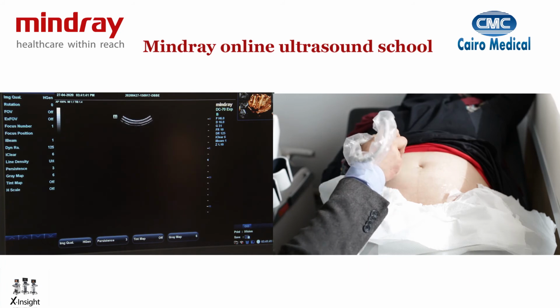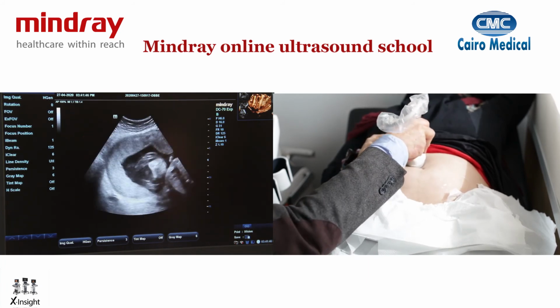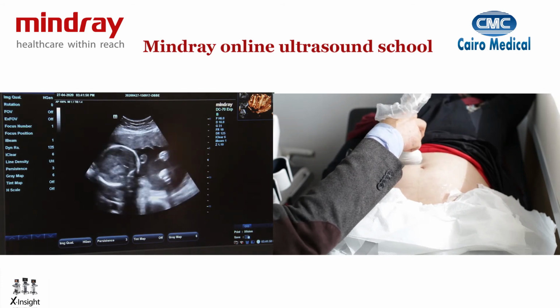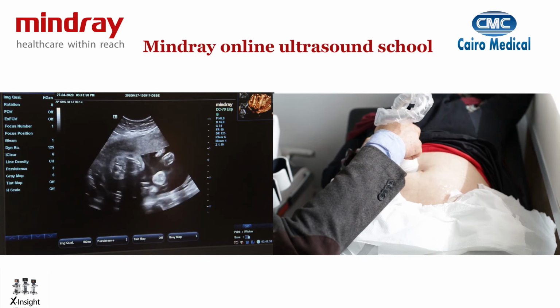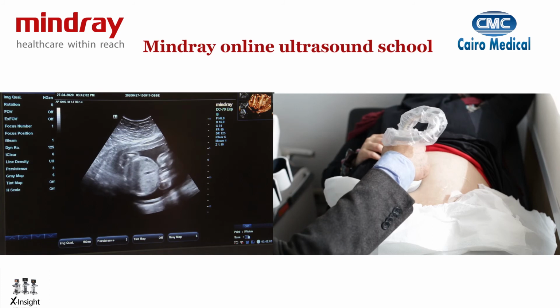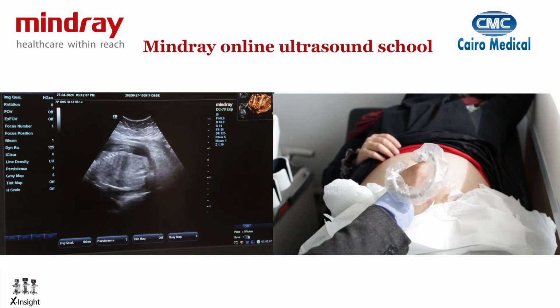Let's do one final sweep across the baby's body again. So always put your probe longitudinal, see where the midline echo of the brain is. Move 90 degrees with the probe touching the abdomen, still at 90 degrees. You can see the biparietal head circumference or the brain structures. If you sweep across the baby's body, you'll see the heart. Below the heart, you'll see the stomach, cord insertion. And when you see the iliac bone, you can rotate 90 degrees and see the femur.